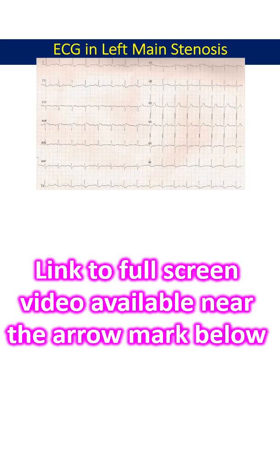A similar ECG pattern can also occur in severe proximal triple vessel disease. The previous ECG is shown here for comparison, which shows minimal changes, with minimal ST segment elevation in AVR as well. This highlights the need for serial ECGs in acute coronary syndrome, as initial ECGs may be near normal even in those with severe disease.